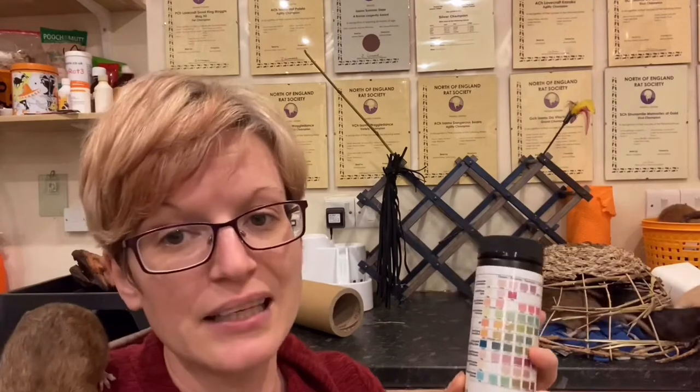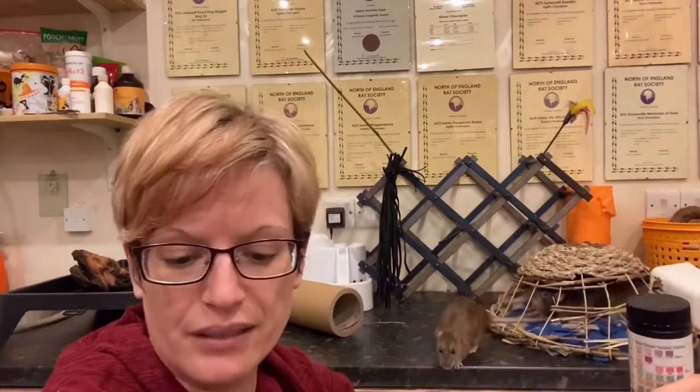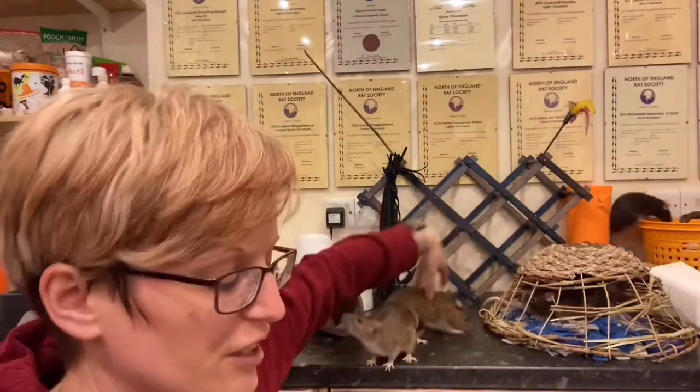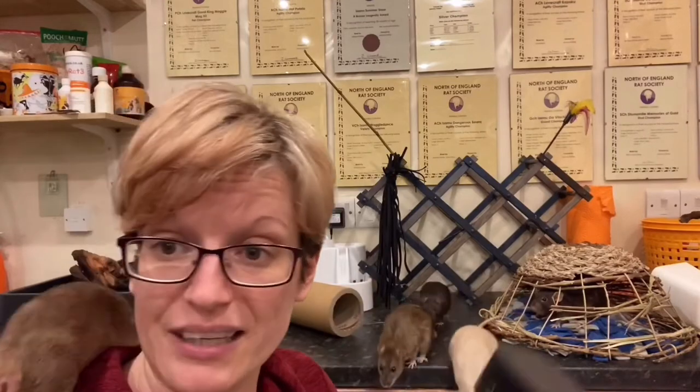Next one: glucose. Glucose indicates diabetes in rats. Diabetes in rats is uncommon, but it does happen and it's something very important to pick up. You'll sometimes even smell a sweetness to the urine. You'll see a rat that's drinking an awful lot — which interestingly is also a symptom of kidney degeneration — and this kind of sweet-smelling urine. Just testing it will pick up the glucose. It's something you can do a fair bit around in terms of controlling the diet, so it's really important to pick it up quickly, go to the vet, get advice, and look at a specific diabetic-friendly diet.